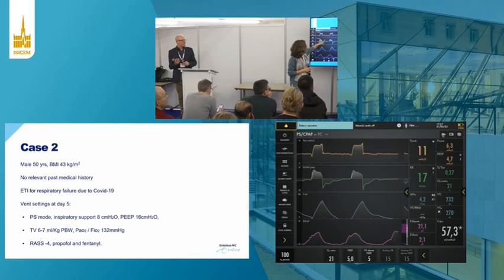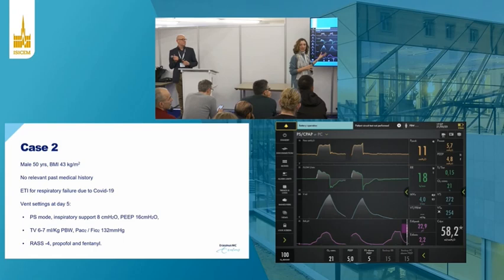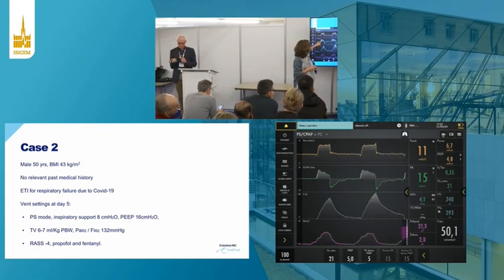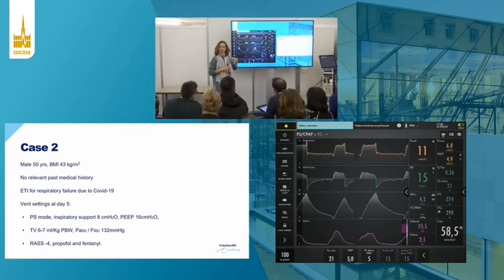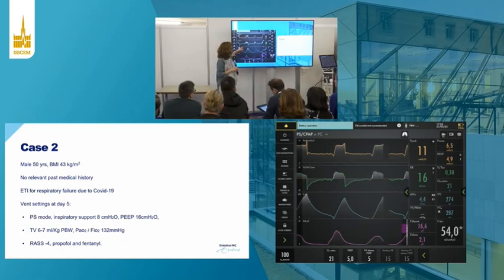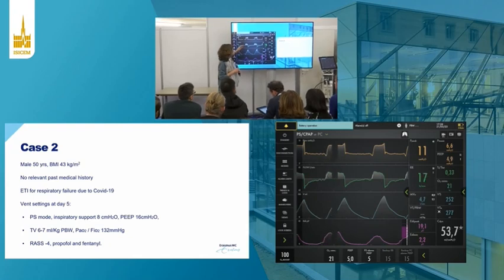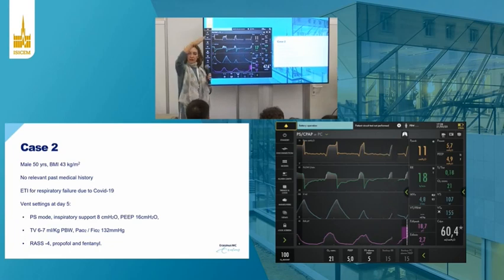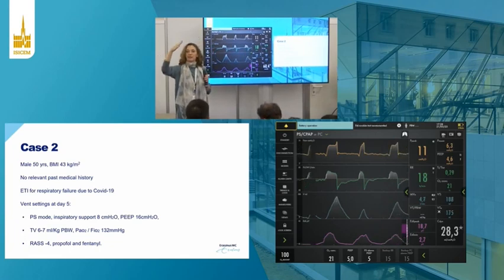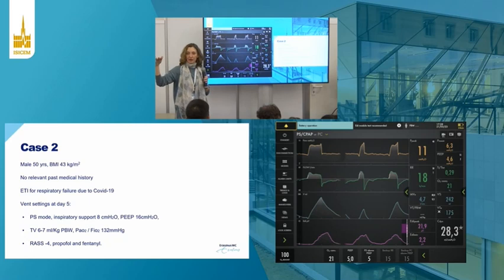So the curvature of the inspiratory flow during pressure support can help us identify the end of neural inspiration. When it's curved, like that one, the patient is contributing to the effort. When it becomes linear, or even if you see a scooping like that, an exponential decay, this is passive ventilation. The patient has relaxed their muscles at that time point.